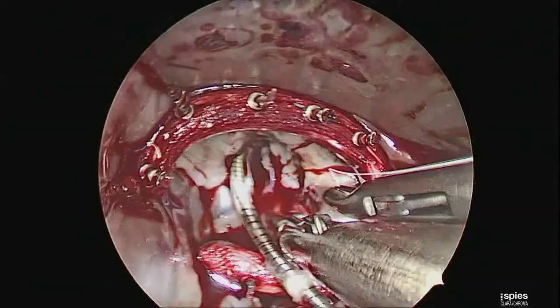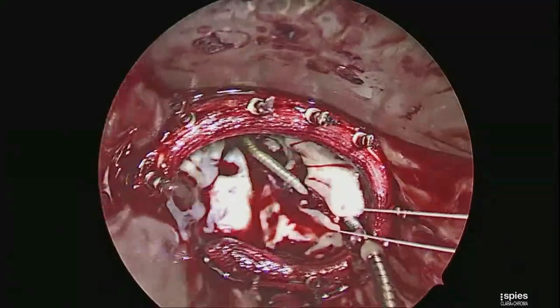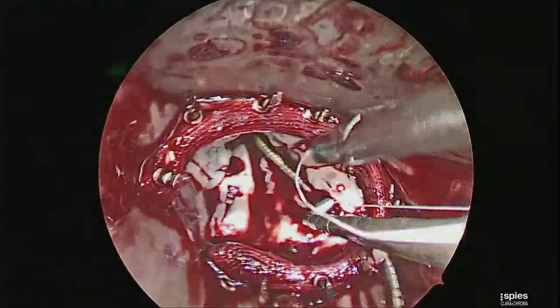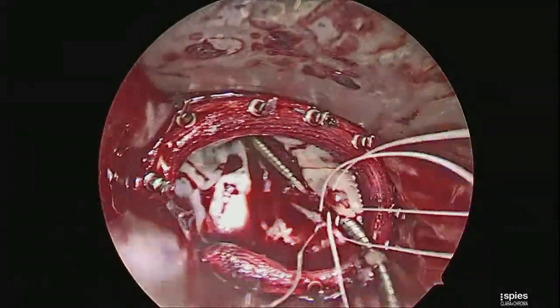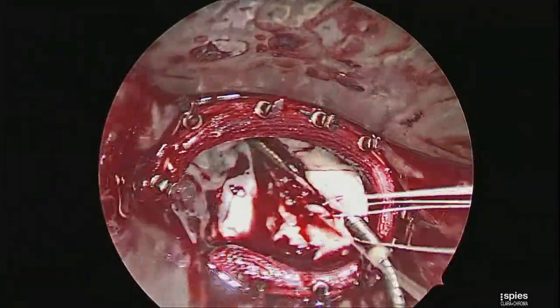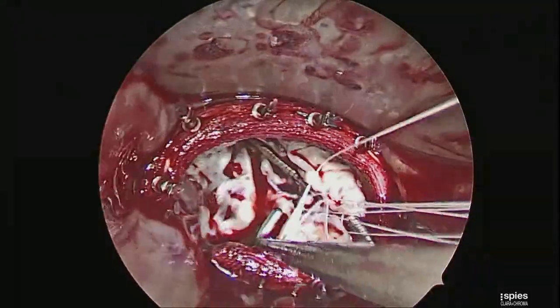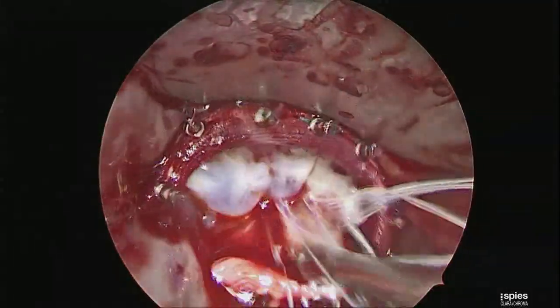The lead is now going to be secured in the commissure between the posterior and septal leaflets using CV-5 Gore-Tex to bicuspidize these two leaflets. In doing so, we prevent the lead from reattaching itself to one of the leaflets on the atrial side and restricting them.